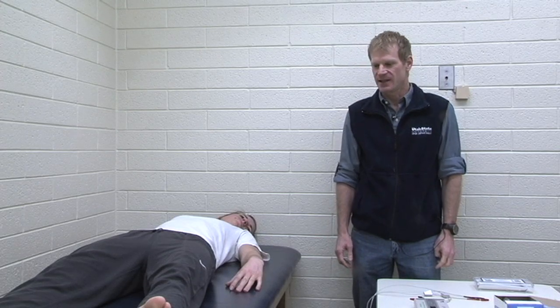Hi, I'm Dr. Dale Wagner, an exercise physiologist, and we're here in the lab today to do a body composition measurement. We're going to be doing that measurement using bioelectrical impedance analysis, commonly just referred to as BIA.